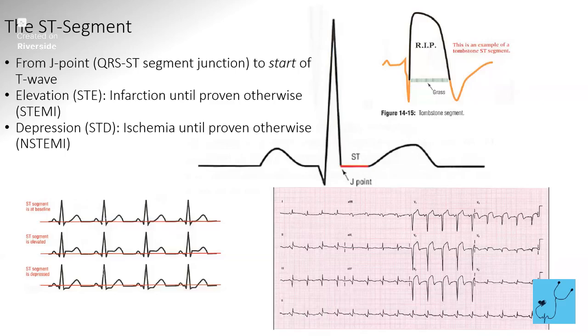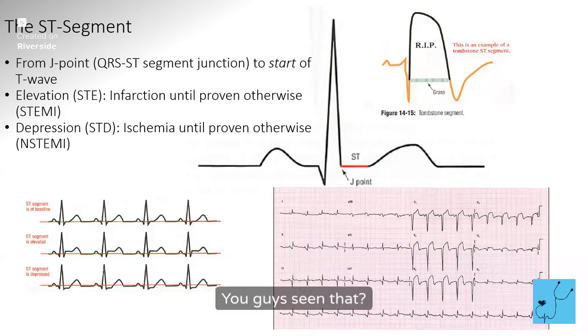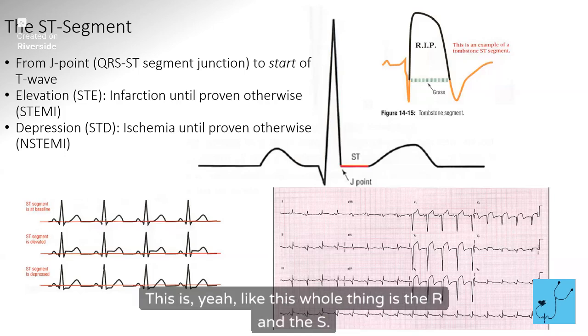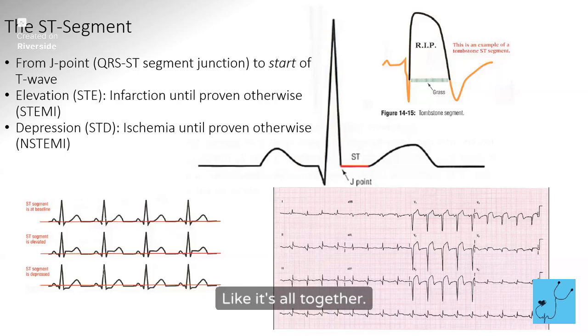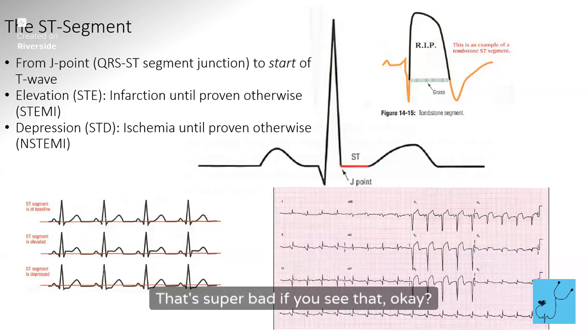Okay. And when they say it's a tombstone, it's because it looks like a tombstone. You guys seen that? That pretty much means the R goes into that tombstone effect, right? Like this whole thing is the R and the S, it's all together. You can't really discern. That patient's dying right now. We're getting ready to code MI, going to the cath lab. We're going to try to save their life. That's super bad if you see that. Okay.